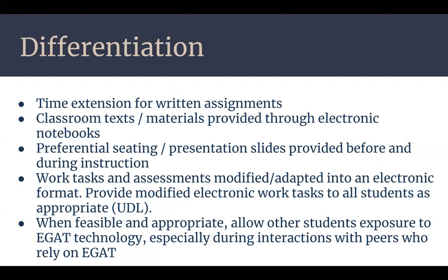Time extensions can be given for written assignments. As Heath even said, sometimes work using the EGAT progresses slowly. So keeping that in mind and respecting the work and the effort, including some more time extensions so that an individual can use the device with no pressures.